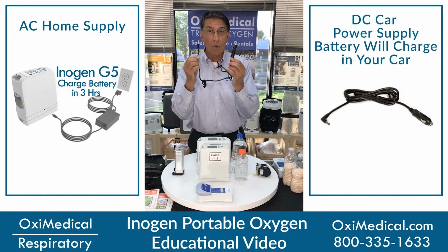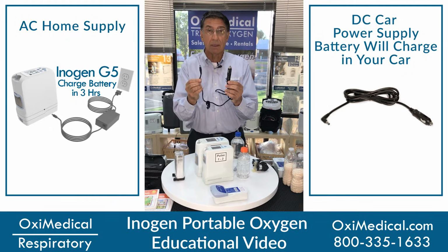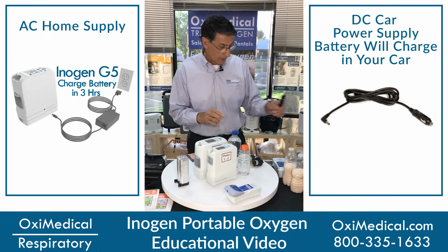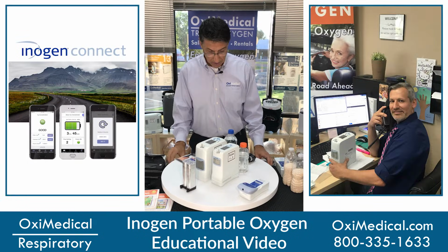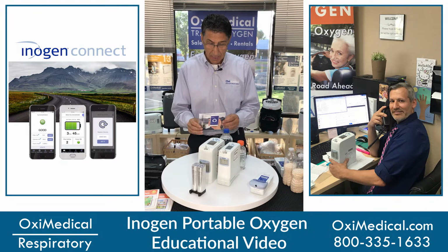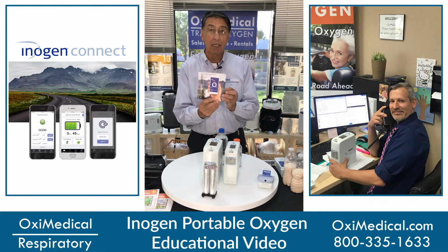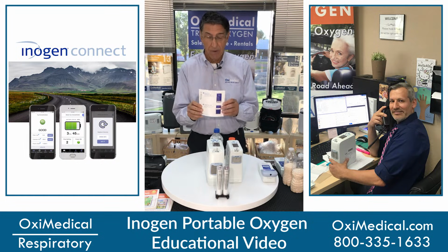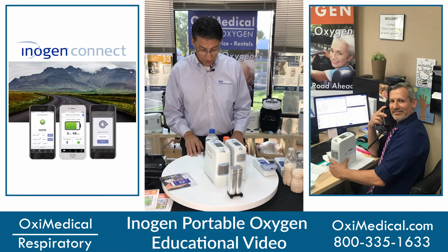Again, I recommend always plugging this into your car outlet so you'll have endless oxygen for the road ahead. You can also have your machine analyzed by us using their Inogen Connect, which connects to your cell phone, and we can bring up your Inogen to see if it needs service.